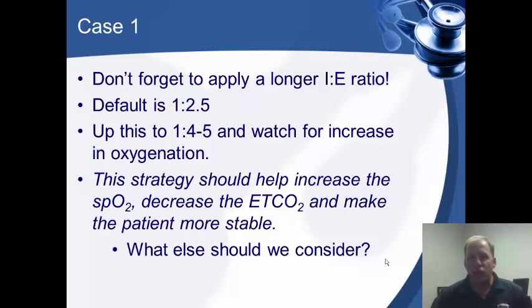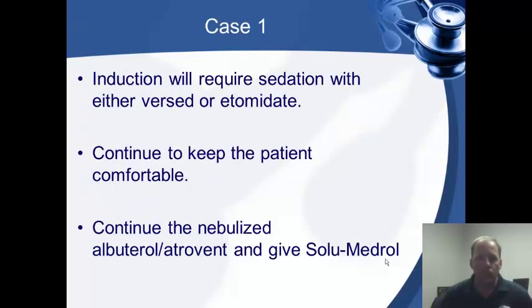This strategy should help increase the SpO2, should decrease her CO2, and make her more stable. So what else should we consider? We got to induce her with sedation, and so we probably want to give her a break and make sure that she's sedated, and then maybe do some pain control potentially. We want to keep her comfortable and continue to ventilate her and continue to give our nebulized albuterol and Atrovent. Don't forget to give your Solu-Medrol.